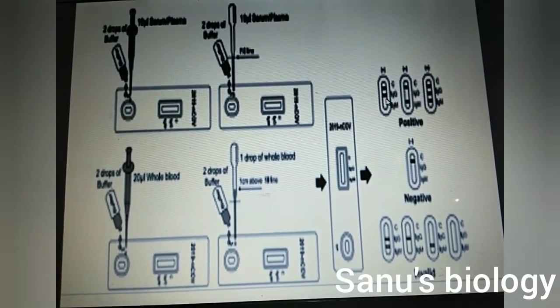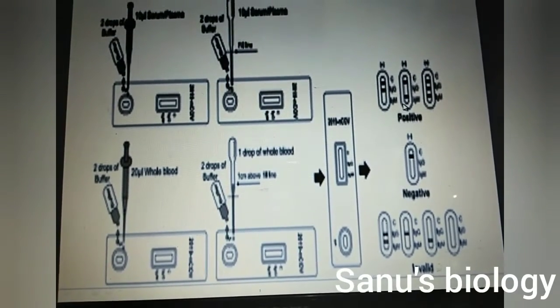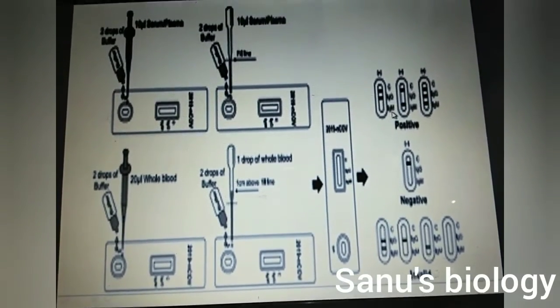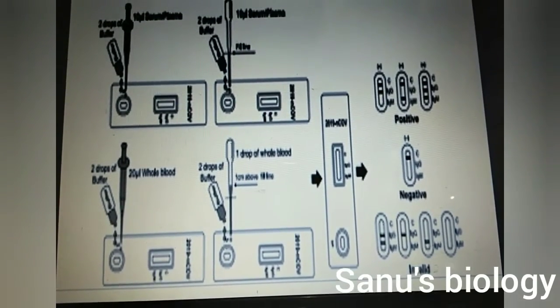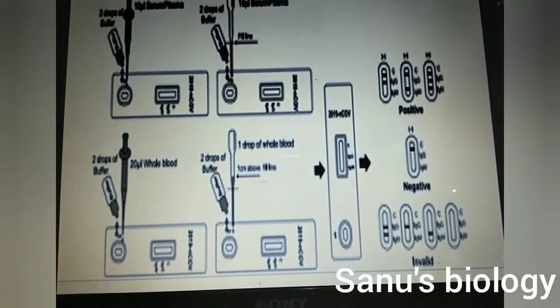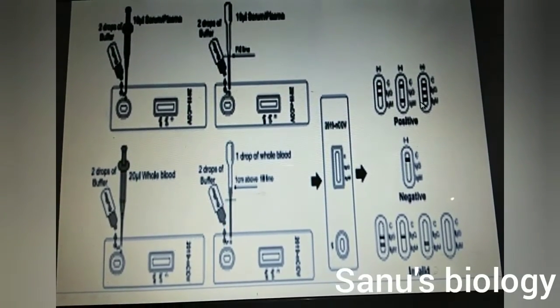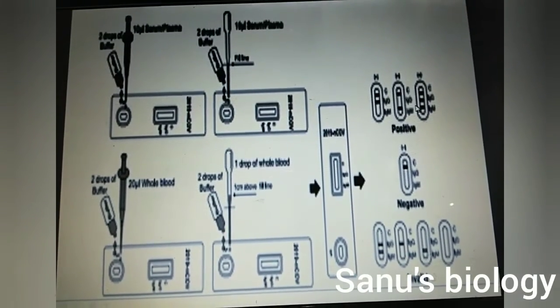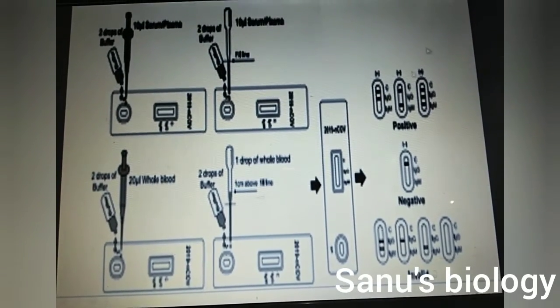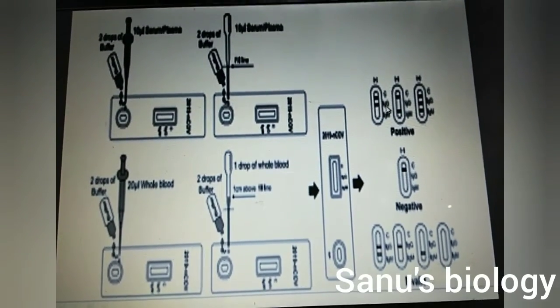The principle behind this is the immune system: if anyone gets infected with coronavirus, they release antibodies, which is IgM firstly. If it is a very long period of infection, then it also comes in IgG. If it is a new infection, it comes only in IgM. If it is very old, a longer time, then it also comes into IgG. If you have been infected more times, then it comes only in IgG.